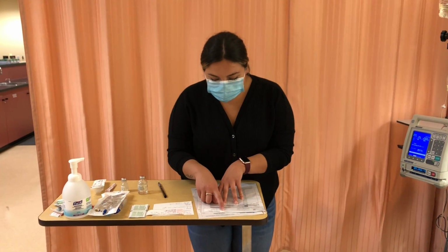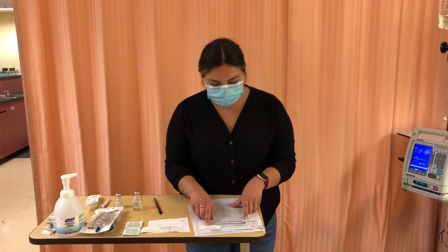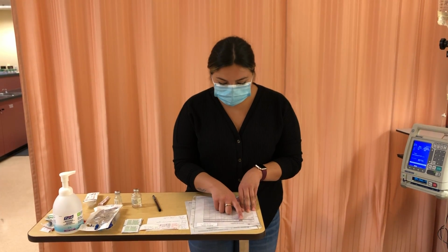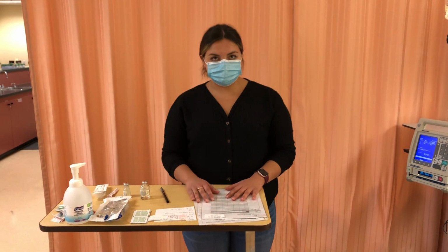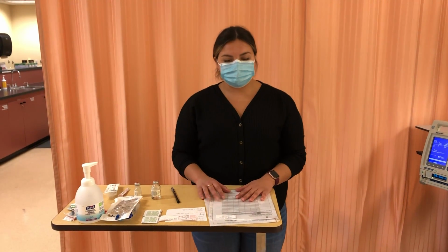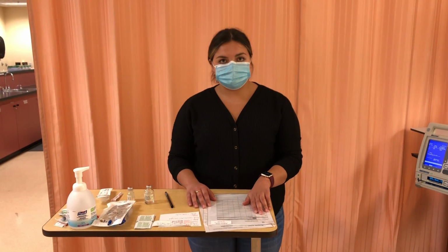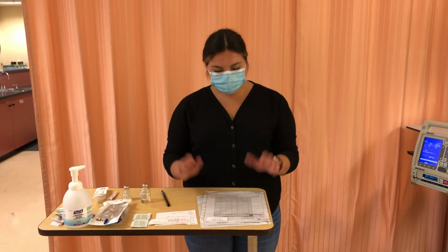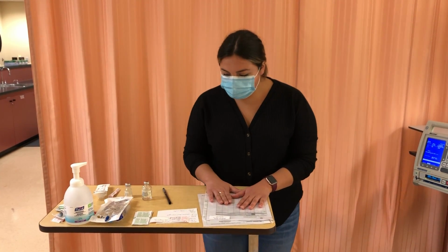So reviewing my patient, I have Emma Wrightson, born on October 20th, 1990 with Dr. Nichols. Patient has no known allergies. She's been prescribed cloxacillin. I have already reviewed the orders to the MAR and ensured that all of the patient information, including allergies and the medication order, have been transcribed by 2 transcribers. So I'm going to go ahead and prep this medication using the MAR.